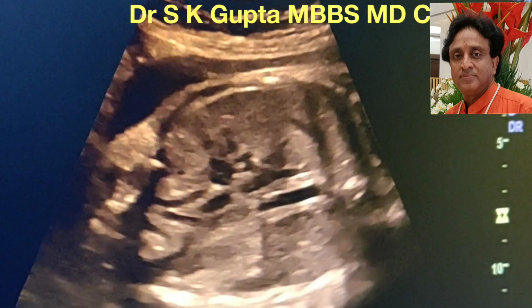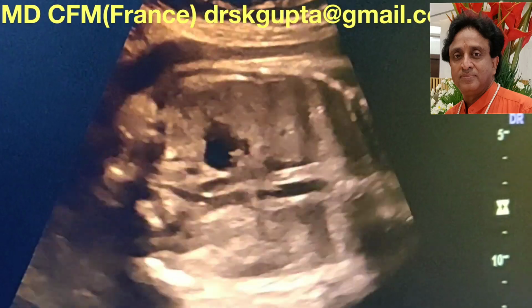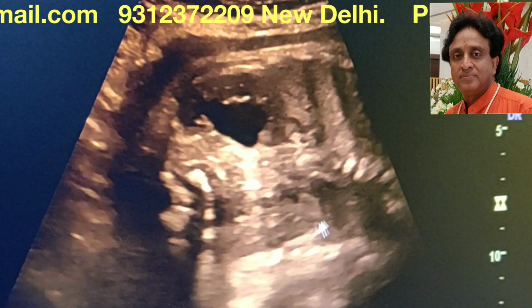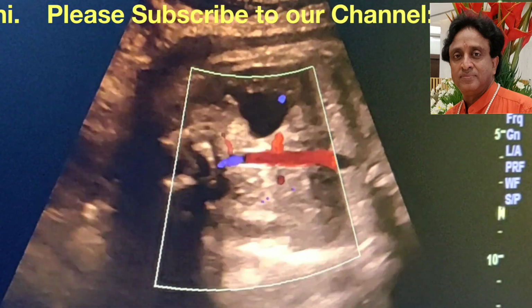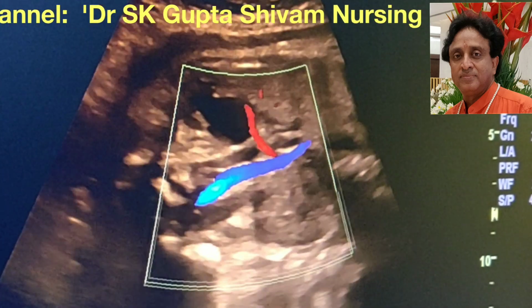This is the right kidney, and this is the left kidney. This is beautifully seen, the left kidney here. I will try to put color. This is the renal vessel. You can see the renal vessel on the left side as well as the right side.